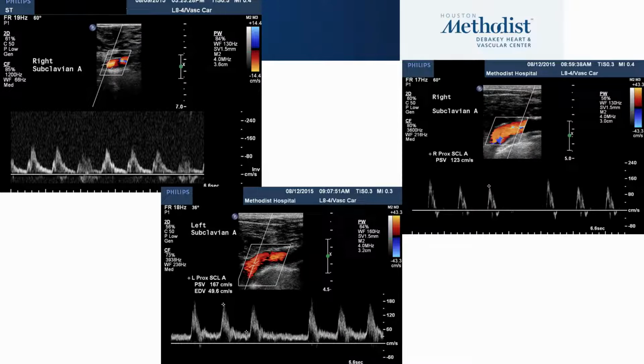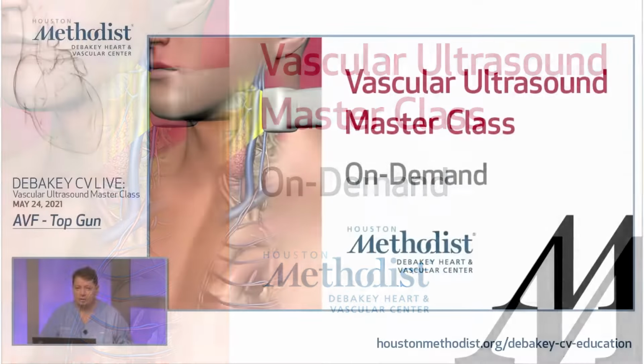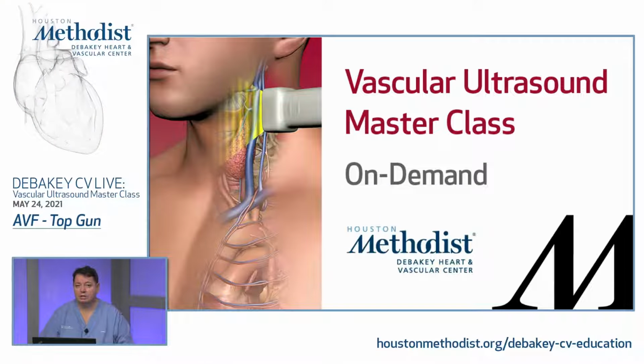So these are my main teaching points, and I just would like to direct you to our Vascular Ultrasound Master Class on demand. We're going to open up our previous conferences, and you're able to see this recording. Dr. Peden, please teach us more skills, what we need to know about the ultrasound on these AVF studies.